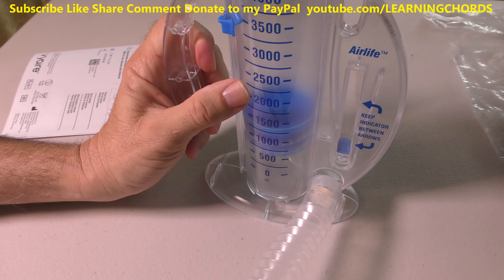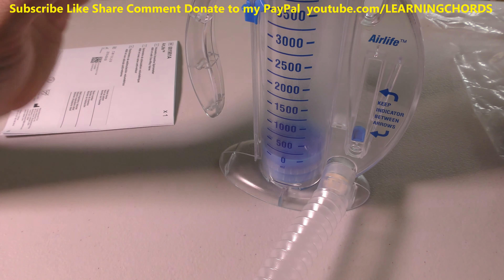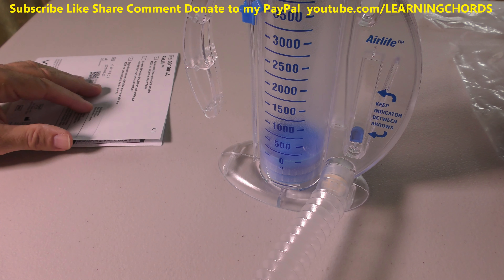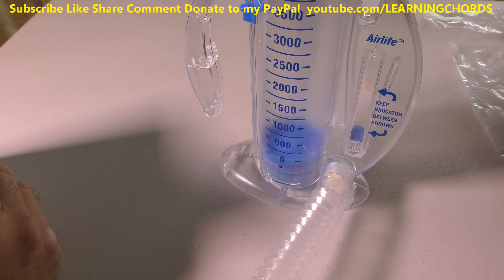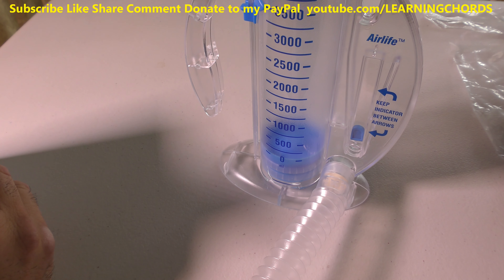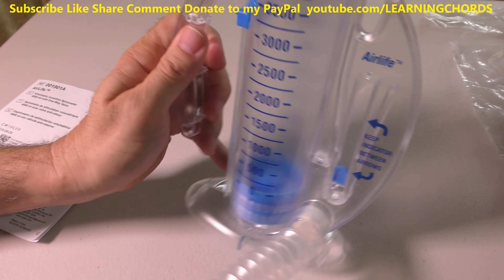So I counted six seconds and at six it was at 20 to 50. If I'm using those instructions, 20 to 50 would mean — am I not even alive? For females, the lung capacity is a lot smaller, but this is a pretty cool little thing.